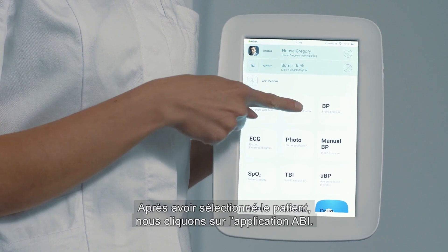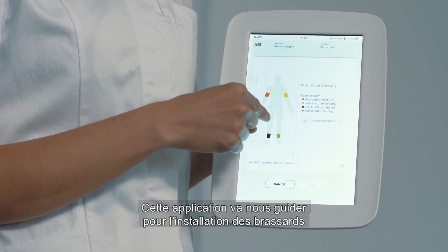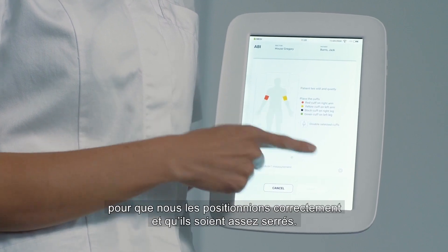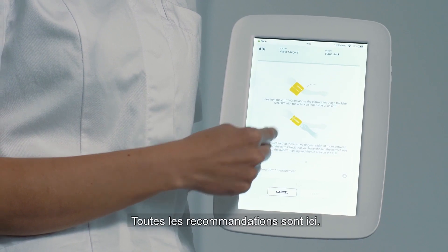After choosing the patient, we will choose the ABI application, and this application will guide us through the cuff placement. We make sure we place the cuffs correctly, fasten them tightly enough, and follow the guidelines completely.